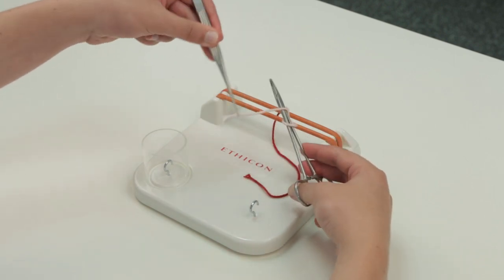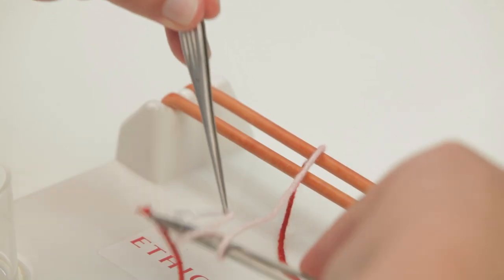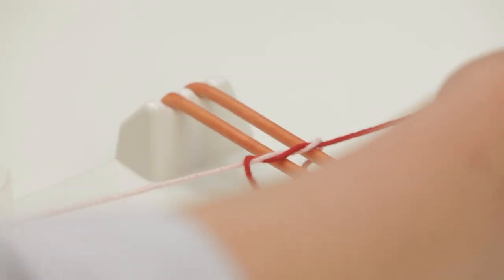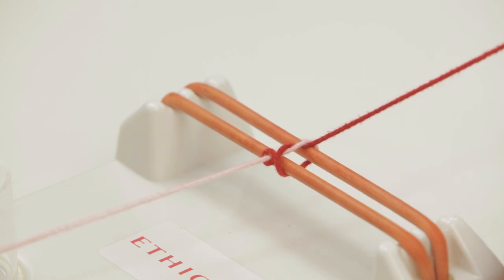Then take the other end of the suture, pull it through the loops and away from you so that a square knot lies flatly on the material being tied.